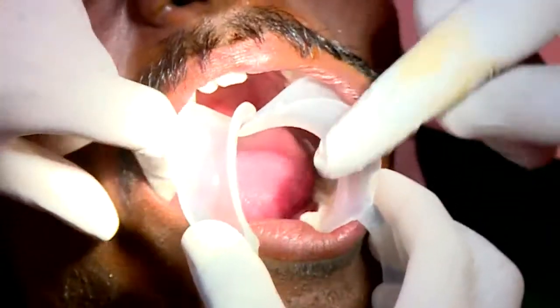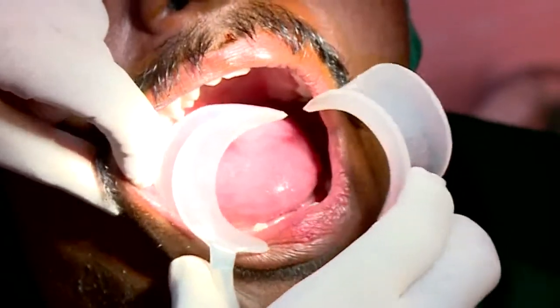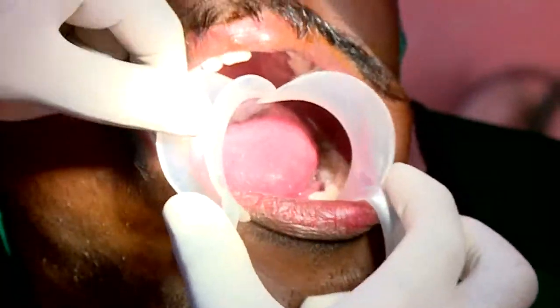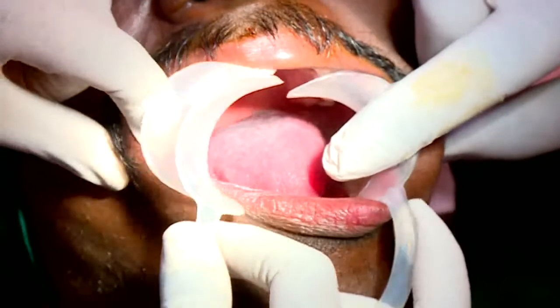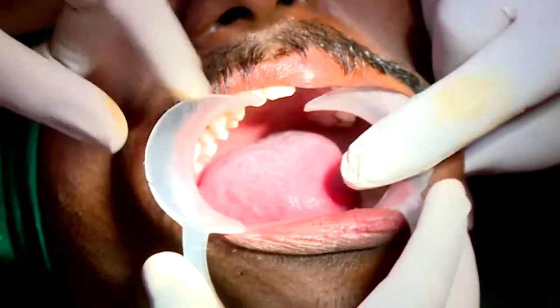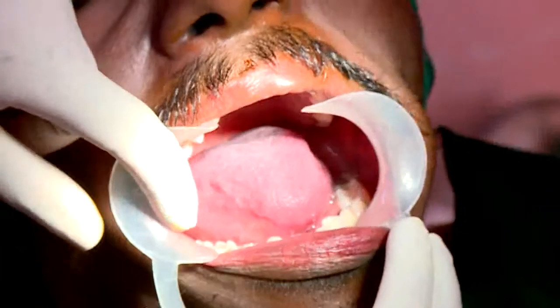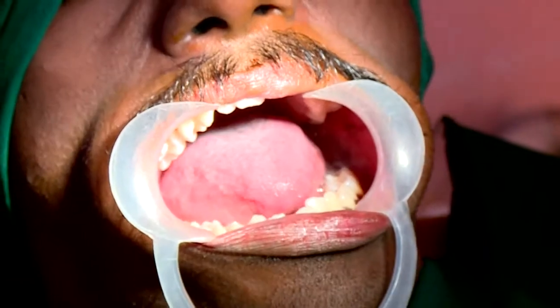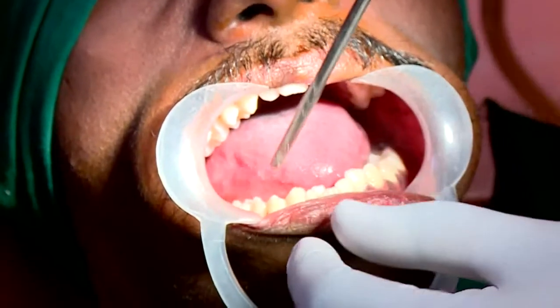So I am applying the cheek retractor for better visualization, sir. Okay, so there are various flaps to use. The most commonly used is a Ward's or a modified Ward's. That is the anterior descending limb, and an intermediate limb and a posterior limb.